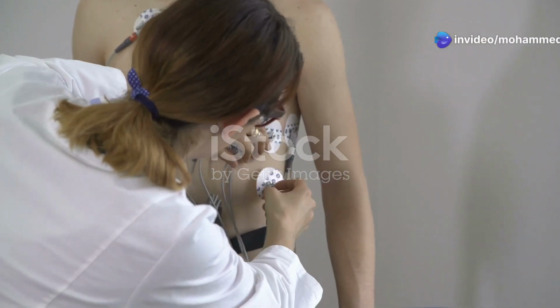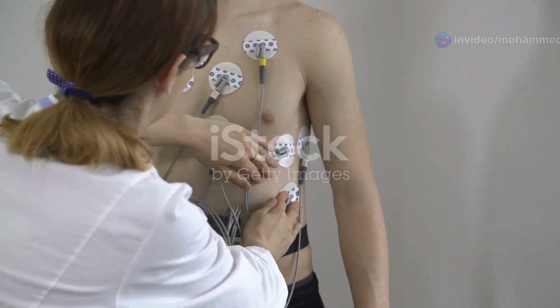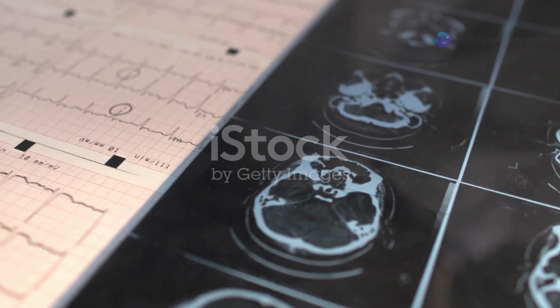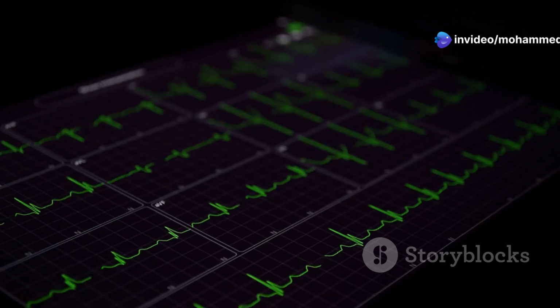An electrocardiogram, or ECG, is a simple test that records the heart's electrical activity. It's a painless and non-invasive procedure. The ECG helps doctors understand how your heart is beating. It shows the heart's rhythm and any abnormalities in the heart's electrical system.